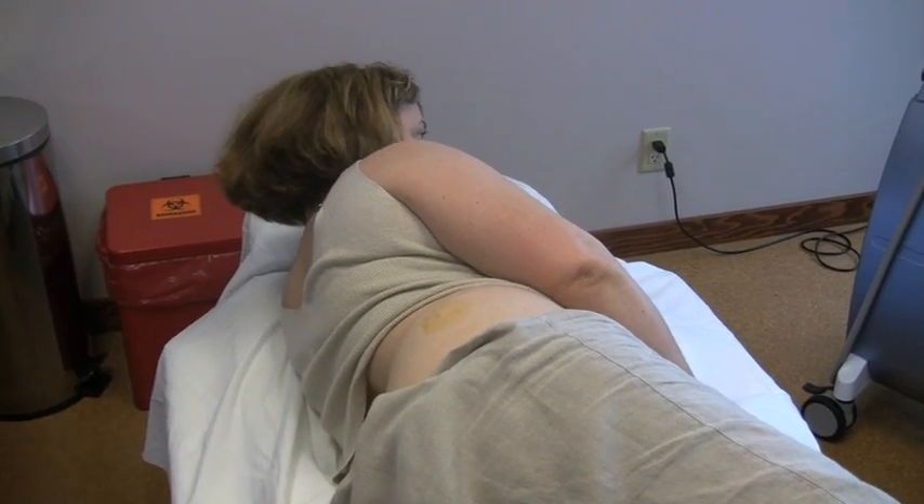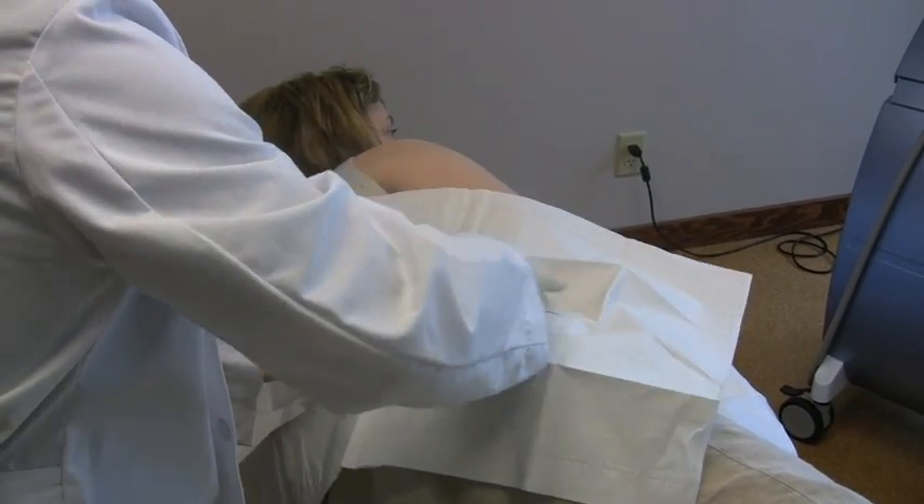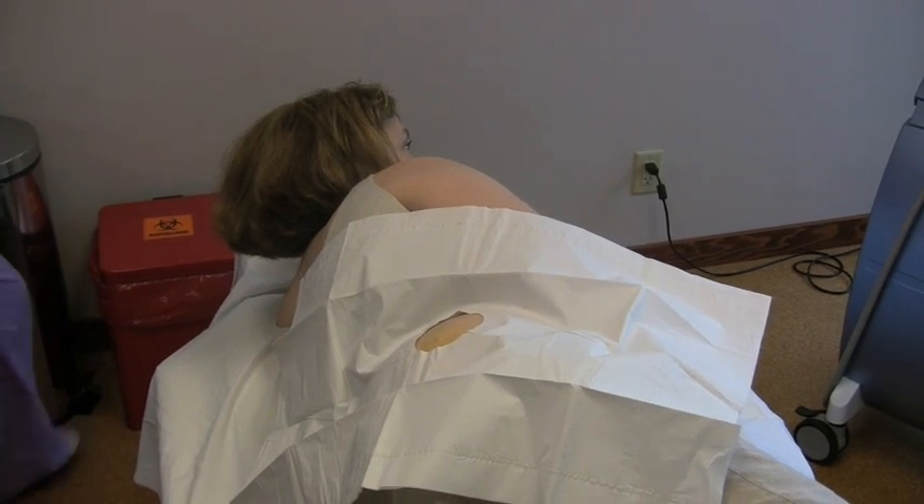You're going to feel a little drape covering you up. If you can stay just the way you are for about 90 seconds, you will probably be done. Wow, that fast.